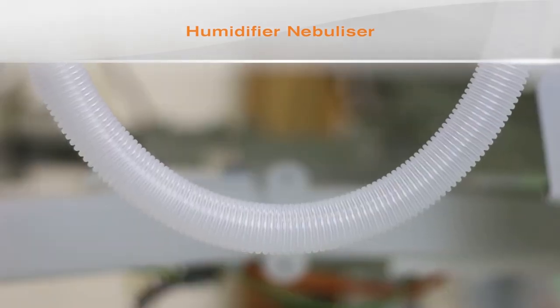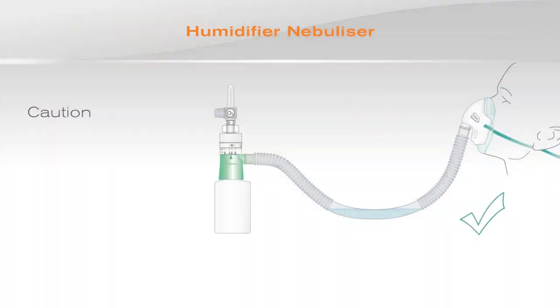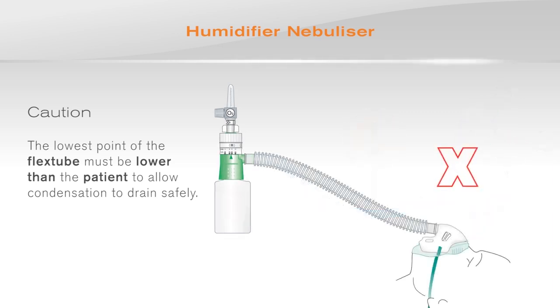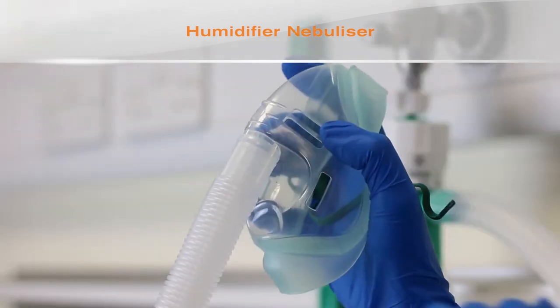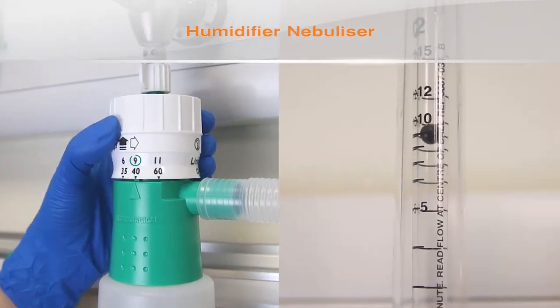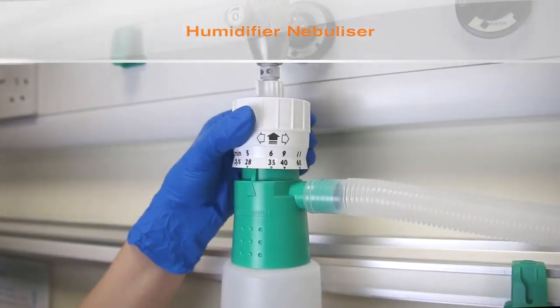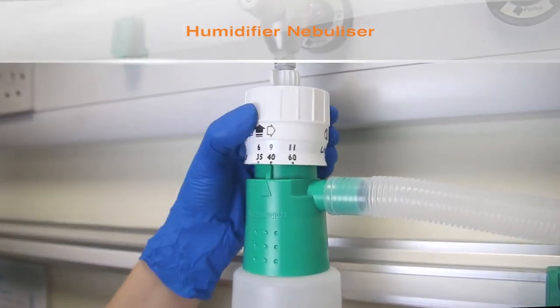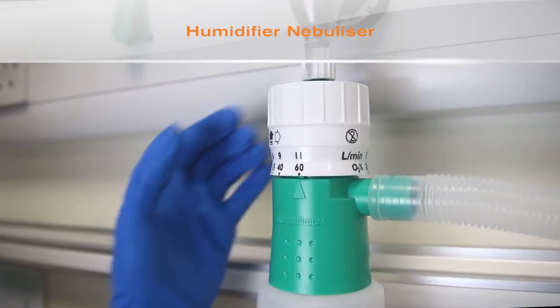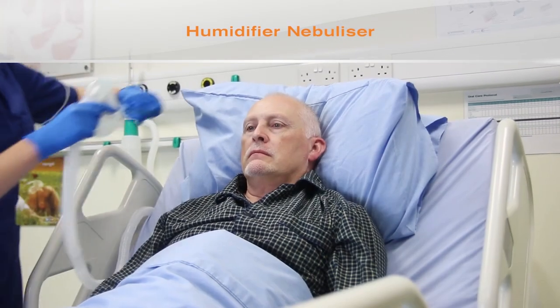It is important to position the tubing so that the lowest point is below the patient and to regularly drain any condensate, to prevent any condensed water from running into the patient or occluding the flex tube. Attach the aerosol mask and then adjust the oxygen concentration to the required level. Set the flow meter to provide the required total flow to the patient. The Intersurgical Aquamist makes this simple by indicating the appropriate flow above each oxygen setting. Then fit the delivery device to the patient.